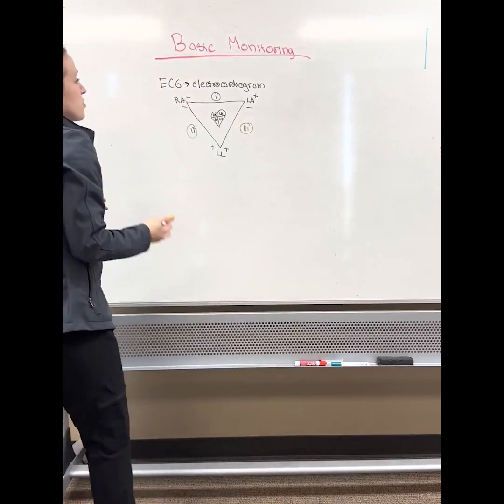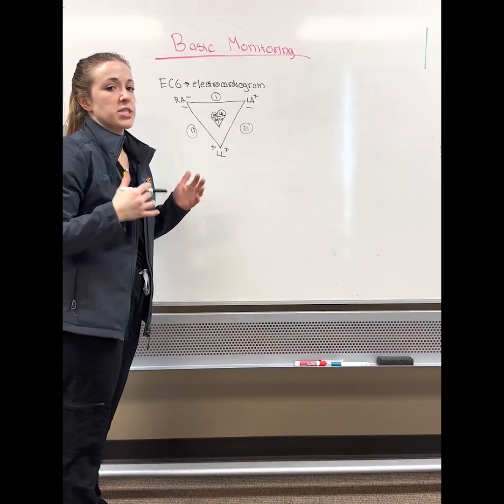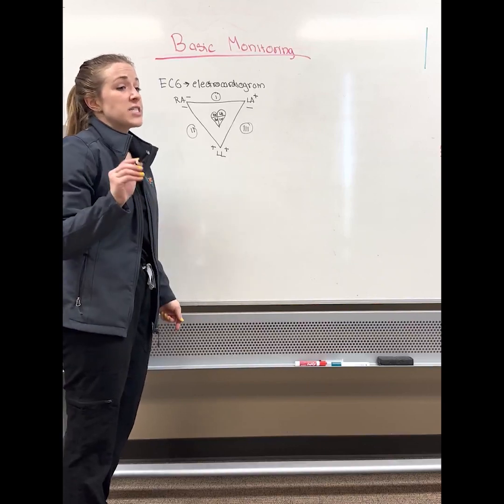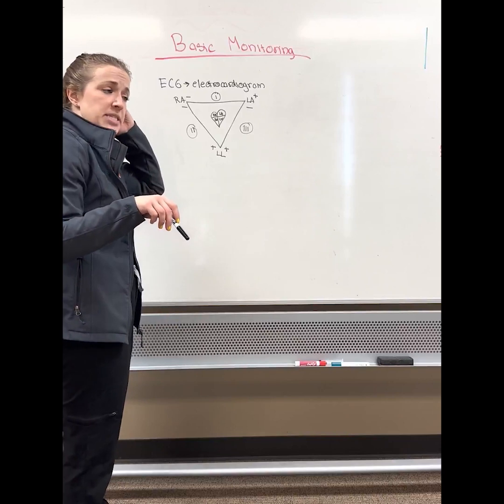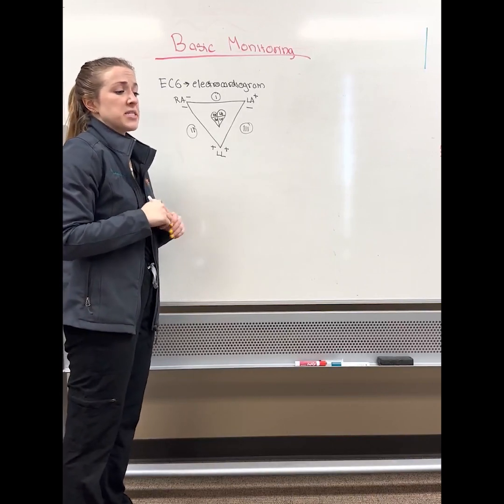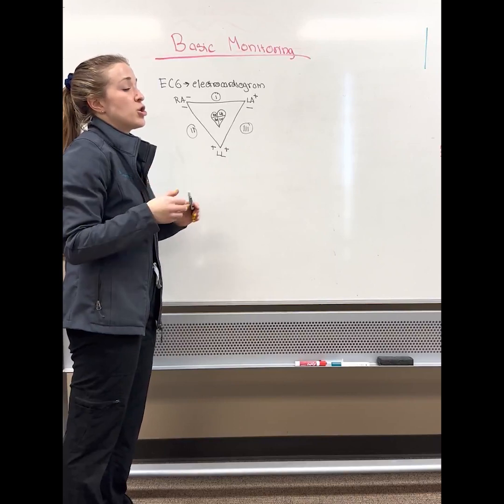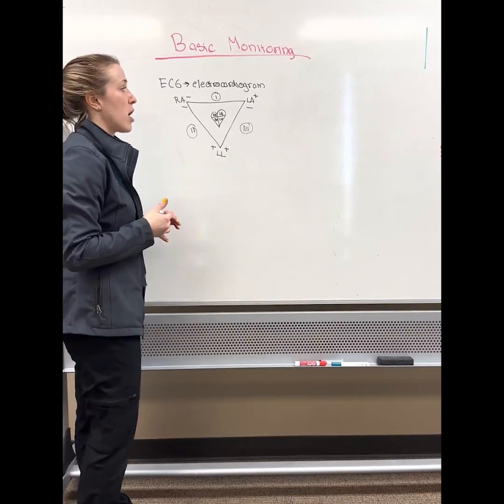Okay, so electrocardiogram. The ECG basically tells you about the patient's electrical activity in their heart. It can tell you about electrical activity and it gives you a heart rate. The ECG does not tell you that the animal is alive. Remember that one of our arrest rhythms in CPR is called pulseless electrical activity. Basically that is electricity in the heart without actual pumping. So don't use an ECG to say your patient is alive. You need to use it in conjunction with other things like blood pressure and capnography.